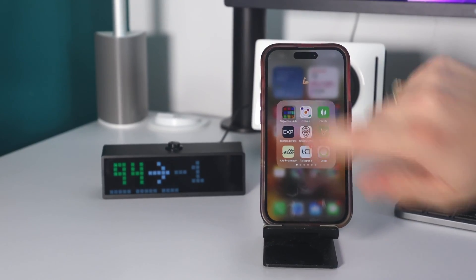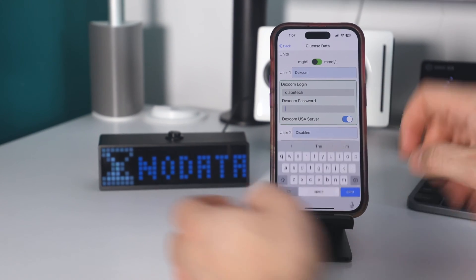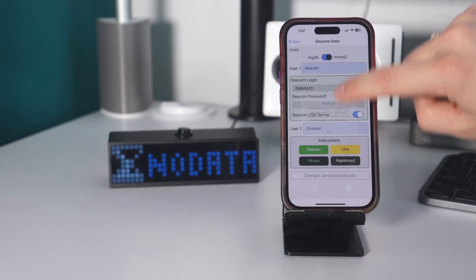Connecting the Sugar Pixel to a CGM is pretty simple. It works with Dexcom and Libre. For Dexcom, you just put in your Dexcom account and the levels will go right up there. For Libre, you have to use the Libre LinkUp app, which is the follow app for Libre. Everything is controlled and set up right on the Sugar Pixel app. On there, you can connect your CGM account and choose the measurement — milligrams per deciliter or millimoles.